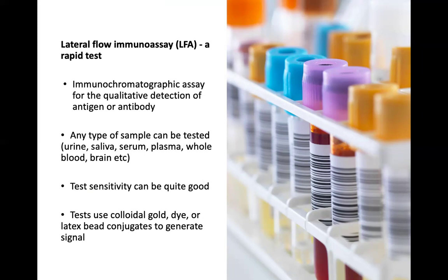But at this moment, I can only share with you the qualitative yes or no rapid test kit or lateral flow. And the type of sample, we will discuss in the second part of my talk. So the first hour will be on the structure of the lateral flow body.